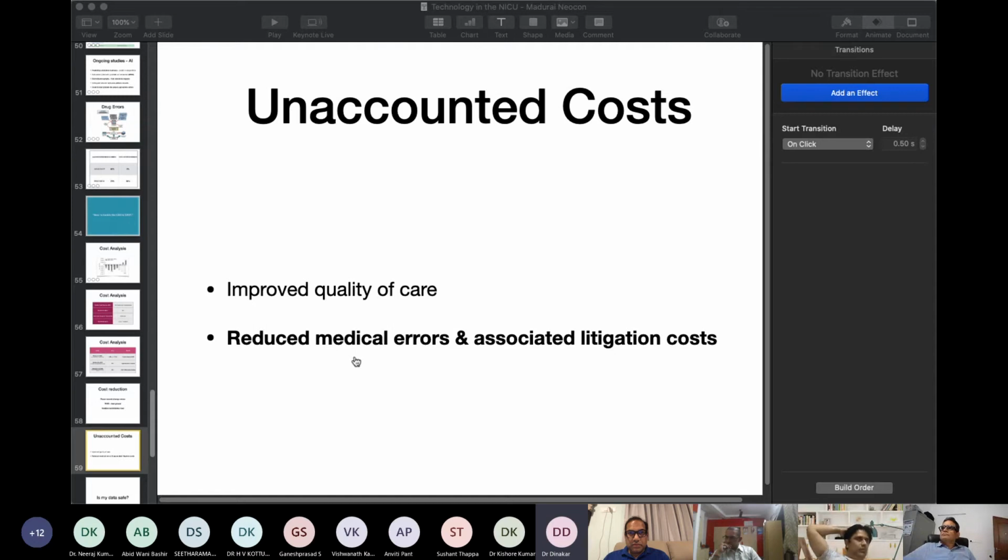They have SpO2, and if the SpO2 comes down, it has an apnea monitor. It will shake the leg of the baby with a vibration. If it comes more than 3 times, according to the definition, it will give an exact alarm that the baby is going for repeated apnea.